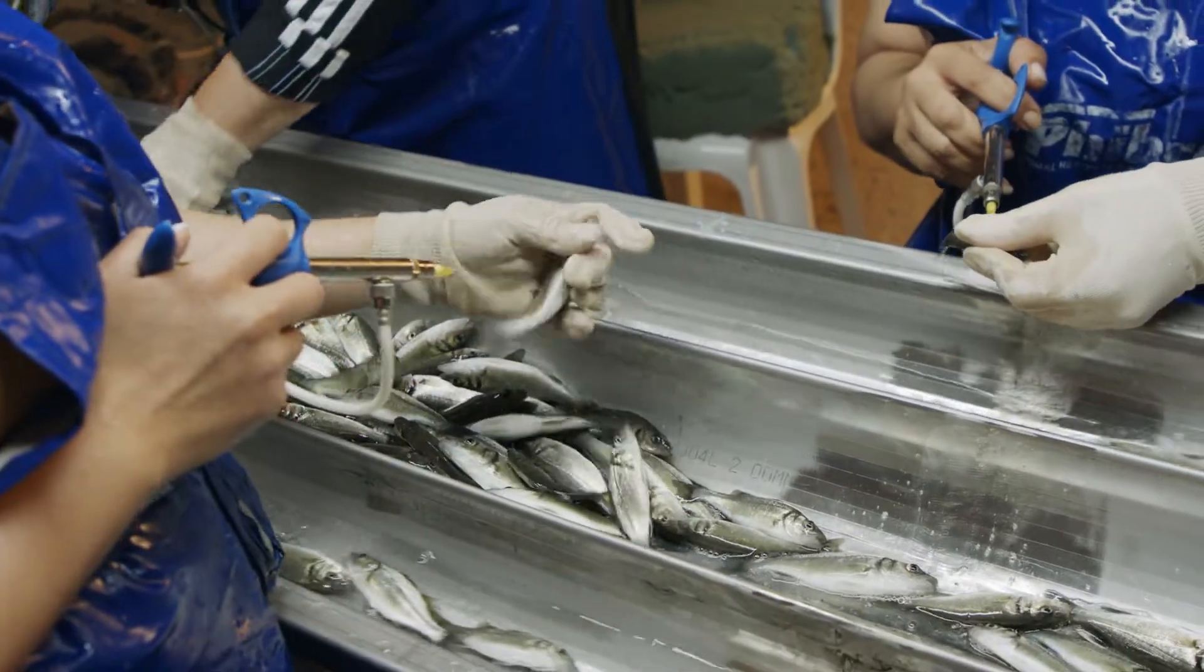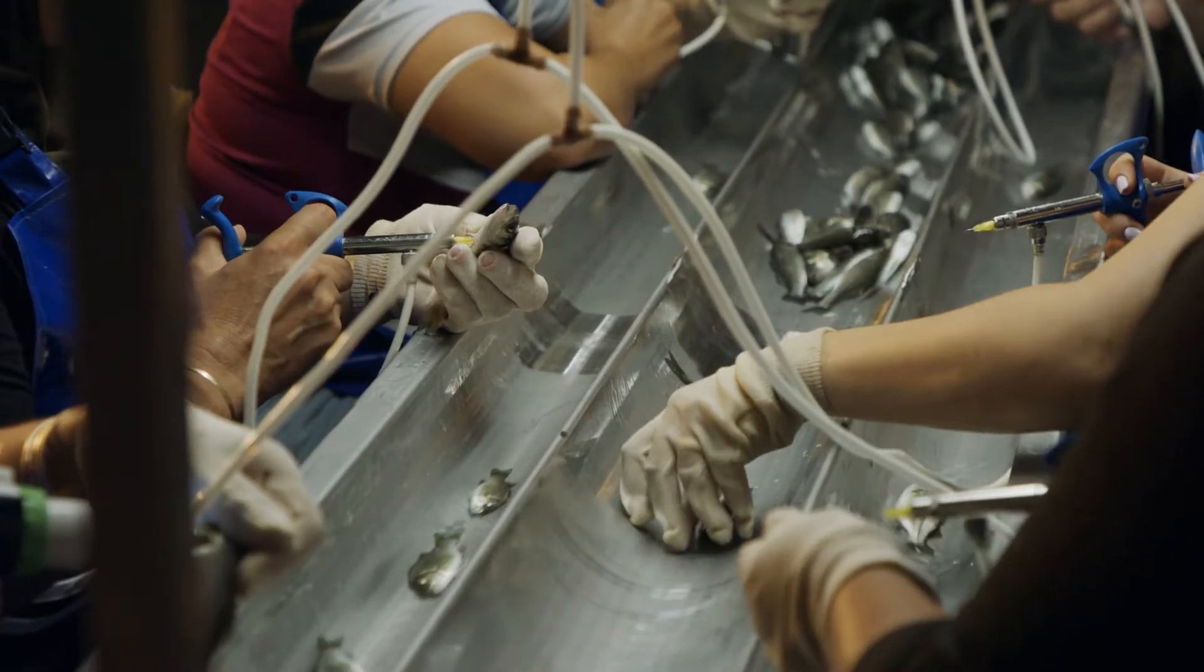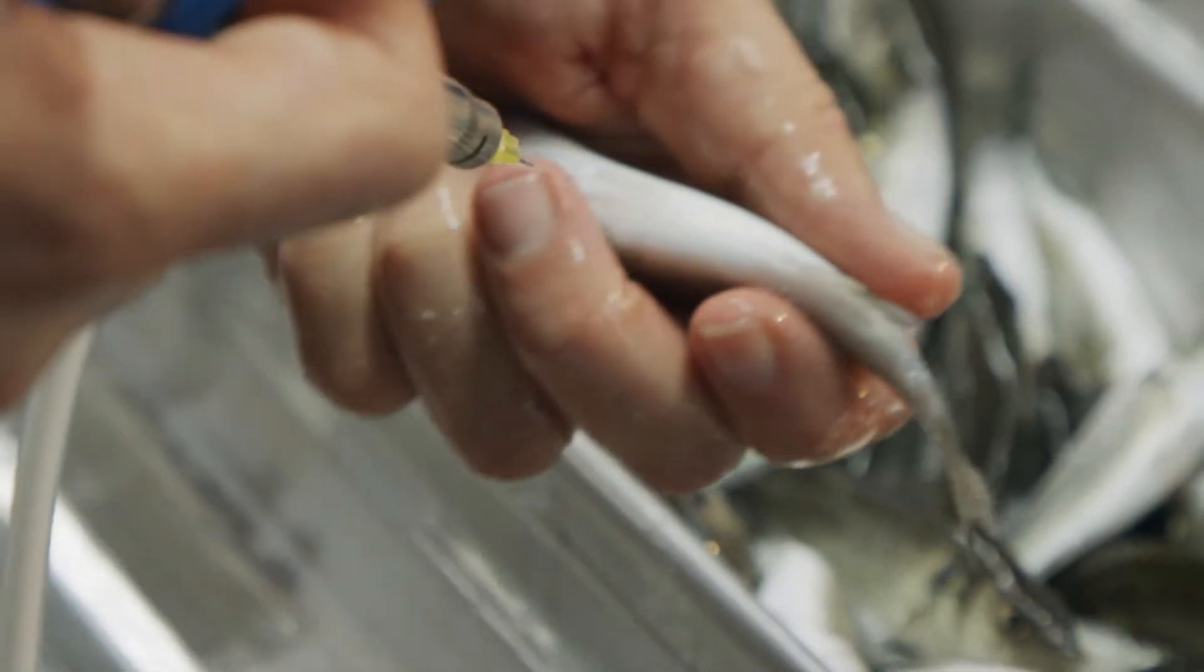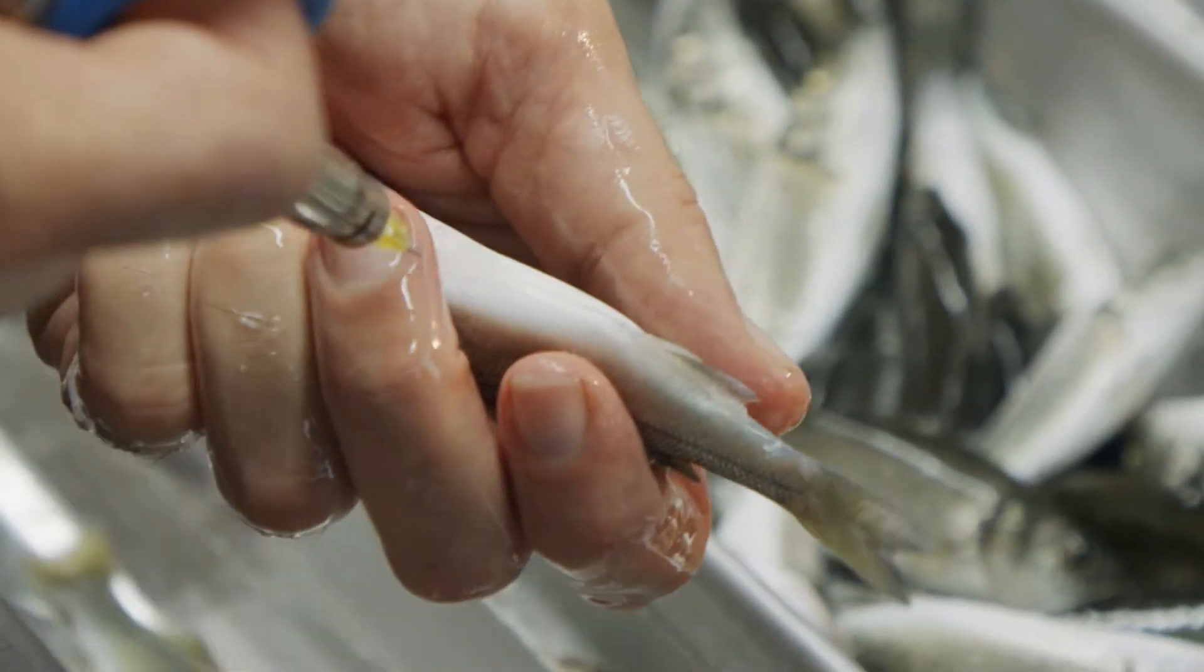Vaccination crews inject large quantities of fish in short periods of time. This can lead to vaccine failure and poor user safety. Oops, that was close.